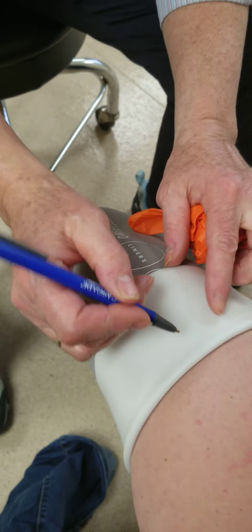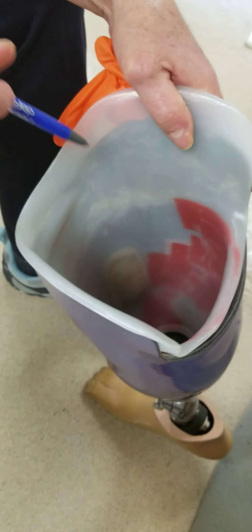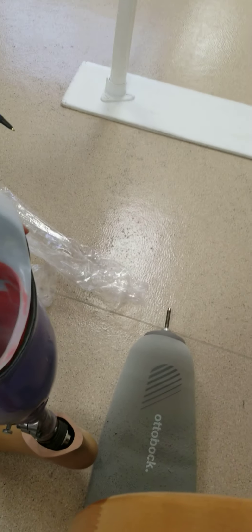You can go ahead and mark that — some people just come with scissors. I'm probably not going to cut it right now since there's not really a need yet. That bolt from that one goes into the bottom of here. We'll probably use a slightly different lock mechanism but it'll look exactly the same — a pin system. Yeah, I think that's the bulldog — is that what it's called?